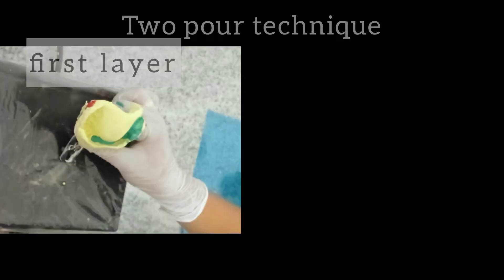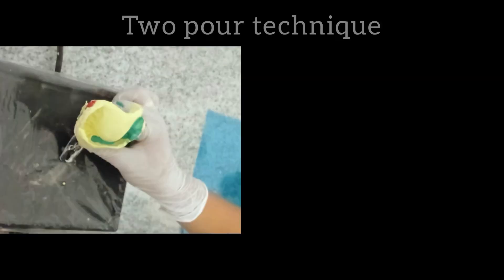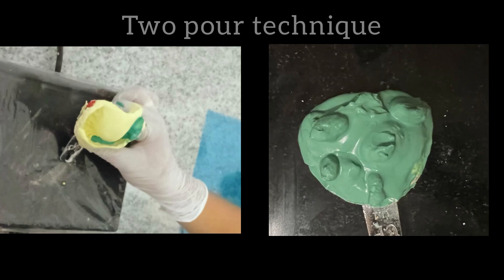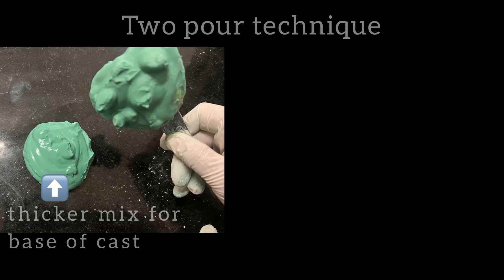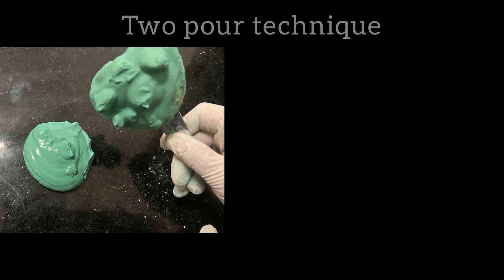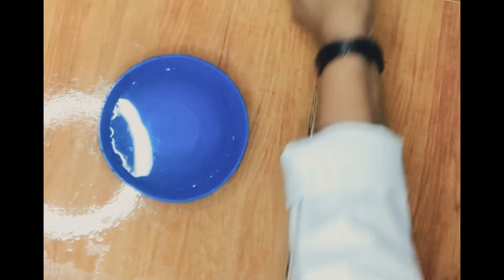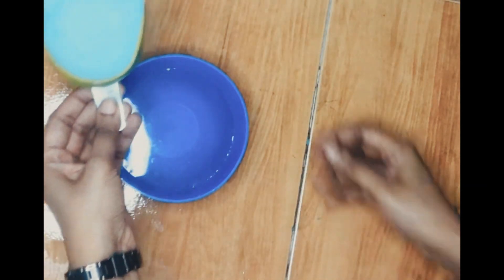In the two-pour technique, the first layer is poured as previously mentioned. Three to four retentive tags are placed over the impression. Wait for initial set of this layer. A thicker mix of stone is then made and poured over the workbench or a tile to mimic the base of the cast. The impression tray with the first pour is inverted over this base, and borders are then perfected using a plaster knife.